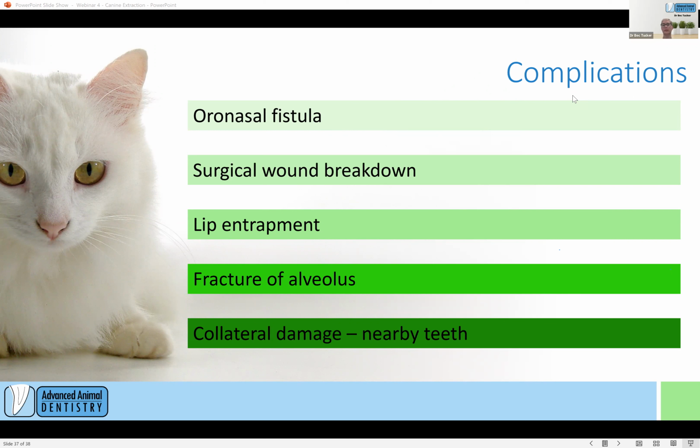The other thing is making the flap a really nice shape. When you've got that V-shaped sort of area of recession and then you pull it down, you'll have these little thin tendrils of flap on the edges. I'll pretty much trim those back almost to the edge where the actual recession extends to. I'll trim it off almost to that level and then pull the whole flap down, and it sits much, much better. It honestly will generally surprise you how much tissue you can actually harvest and migrate down. As I said, 9 times out of 10, we're actually trimming excess off to actually get it to sit nicely.